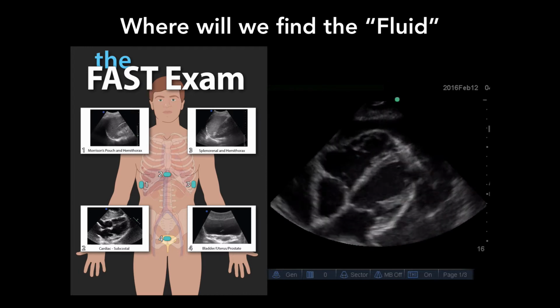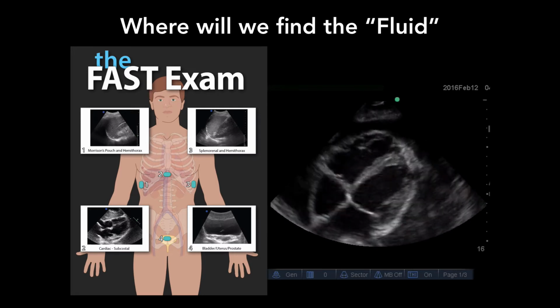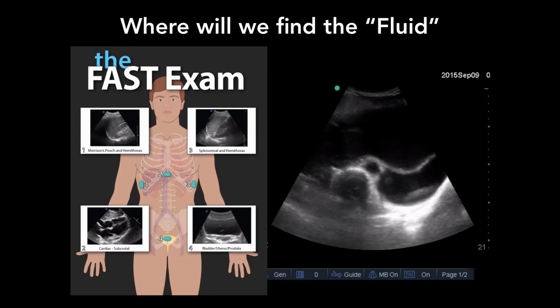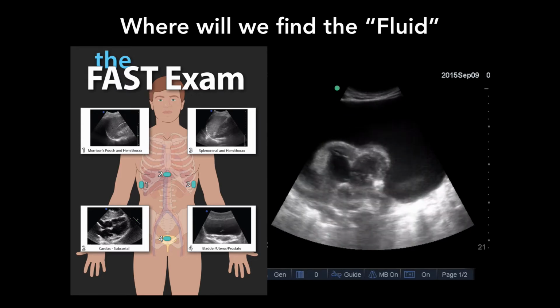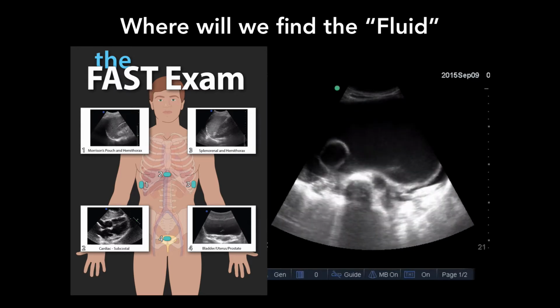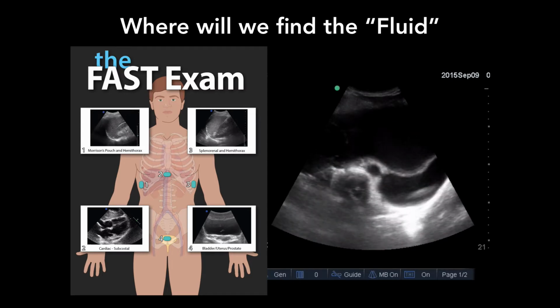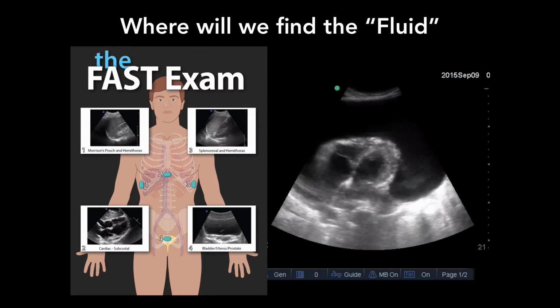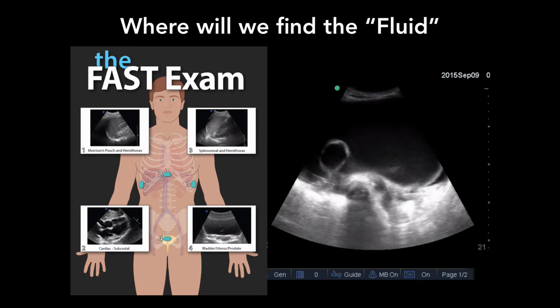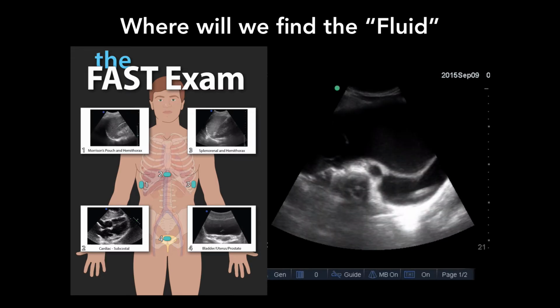Anybody remember what that condition's called when you start getting shocked because of a pericardial effusion? You're going to learn it this year if you don't remember. It's called pericardial tamponade. Look at this effusion. Wow, that's a pretty big effusion, don't you think? So think about how your physical exam would be if you took a stethoscope and you were listening for that heart. What would it sound like? It'd be muffled, right? Does that make sense? Because it's a lot further away. It's the same enemy that ultrasound has. Remember bone, distance, and air? Well, this is distance, right? So your hearing is even less.